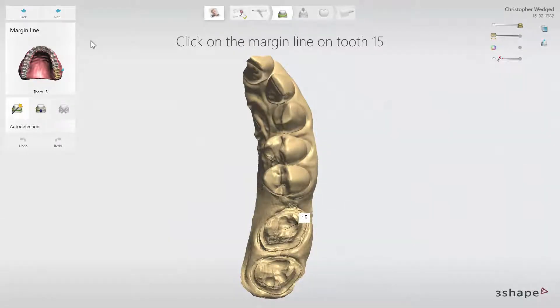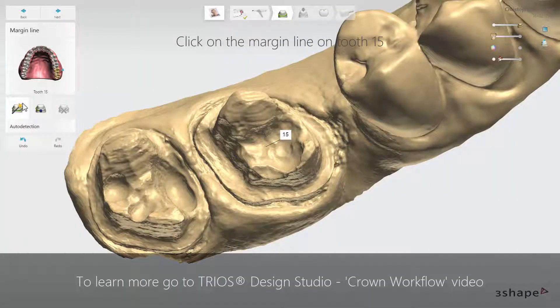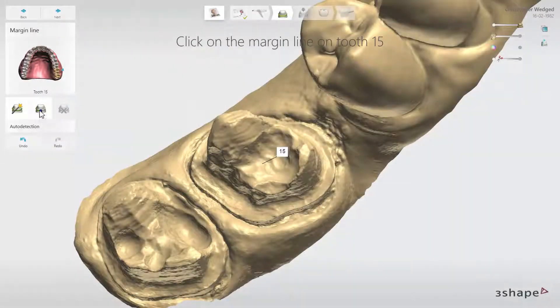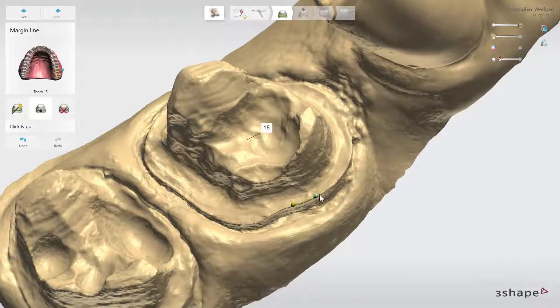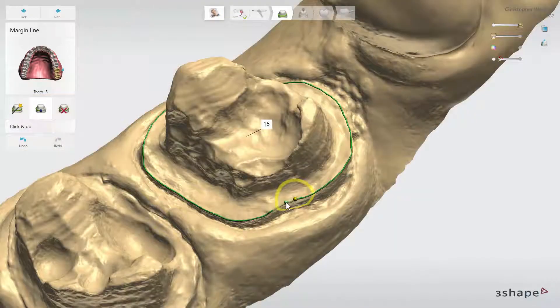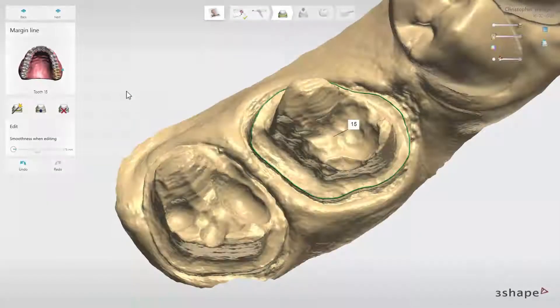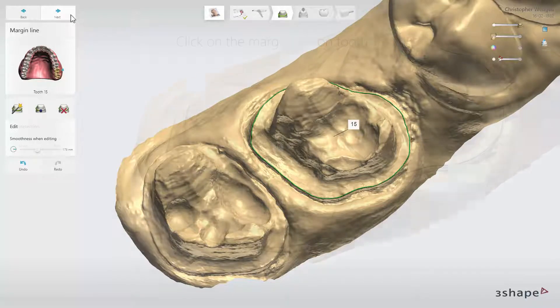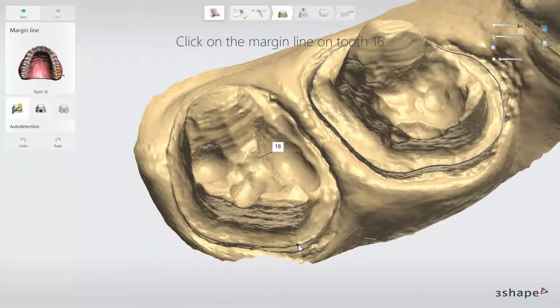The design of the restoration starts after performing scanning. First you have to define the margin line. The tooth you work on is marked in the tooth selector and can be changed at any time. You can set the margin line automatically using auto detection or manually with the click and go option. When you have set the margin line for the first tooth, click on another tooth in the tooth selector or simply click Next to set the margin line for the next restoration.